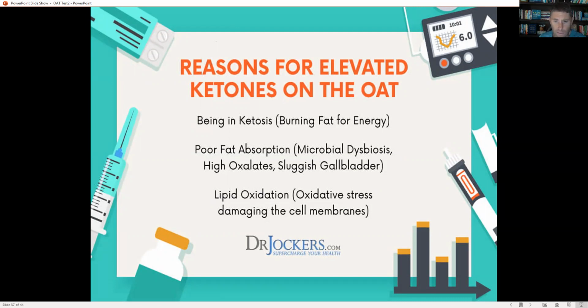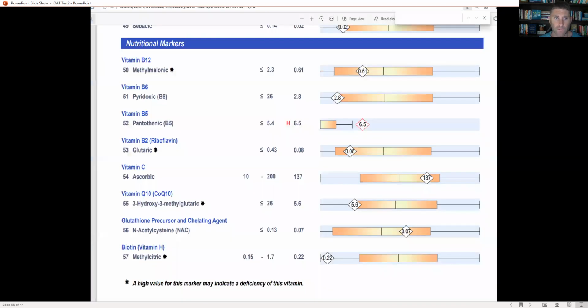So you're looking at this test from a holistic perspective. That's one of the big keys here. We're looking at this holistically, not just in segments, even though, of course, right now, as we're doing this, we're looking at it in segments. You're comparing it with other markers to look for patterns.